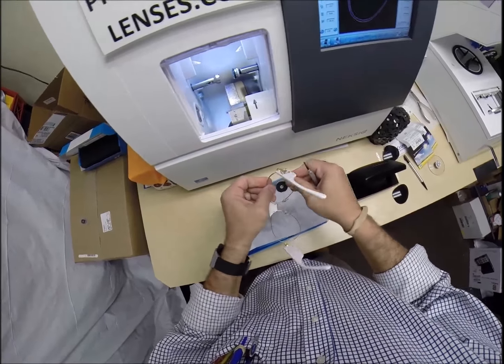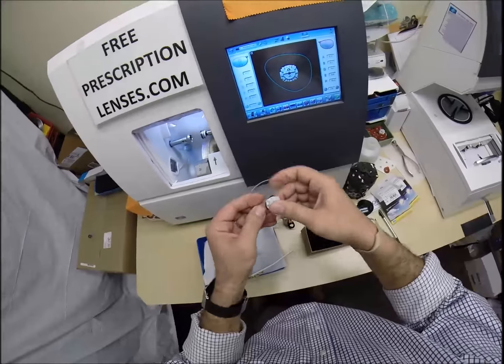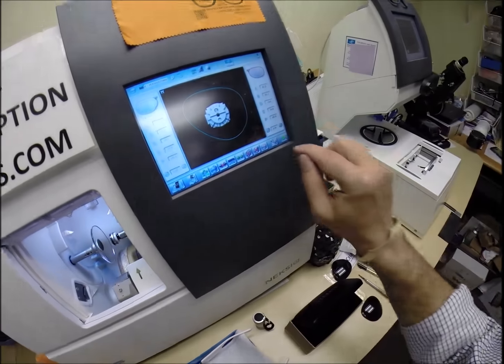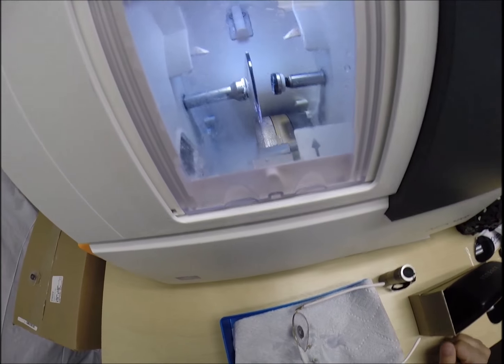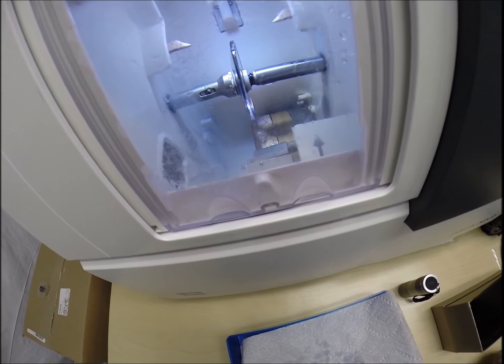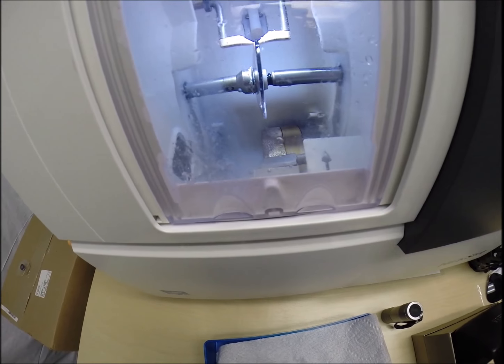And we are good to go. That is in there snug. So let's go ahead and take the left lens, flip that over to L. I'm going to press that on there firmly, place the magnet into the chuck. Hit start just like before, the door closes, the clamp shuts, and then the lens is going to be traced by 2 white styluses, just like before, making sure the lens is large enough to fit, which it barely is.